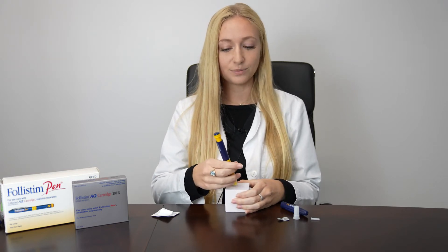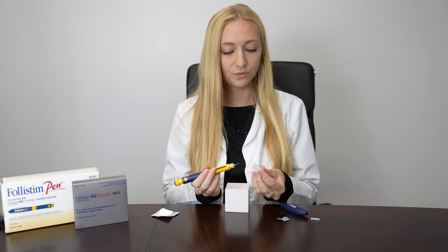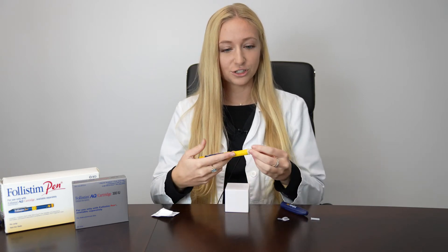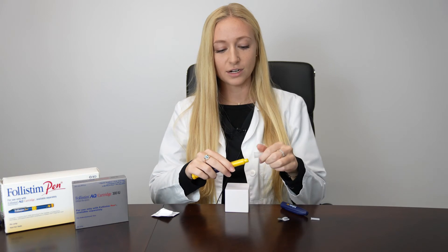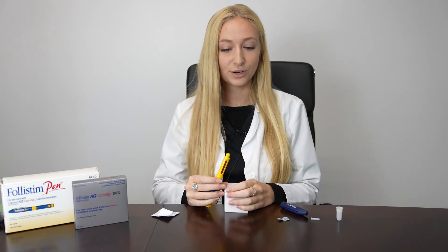If you've taken all the medication, your medication window will now say zero. You can very carefully recap your injection syringe and then discard it into your sharps container. You can place your pen back in the refrigerator if there's extra medication remaining.